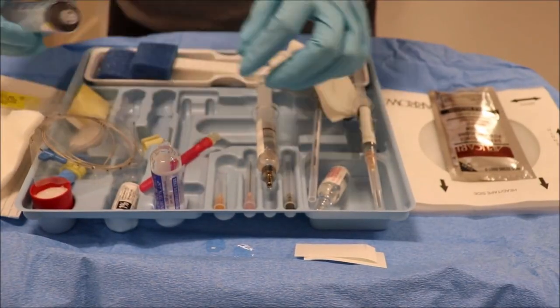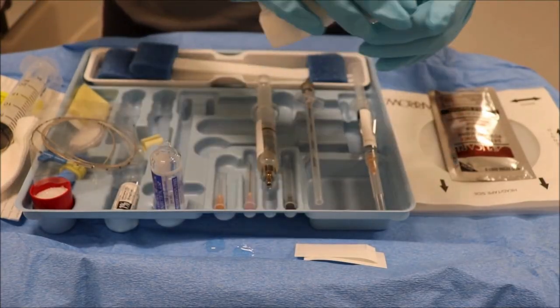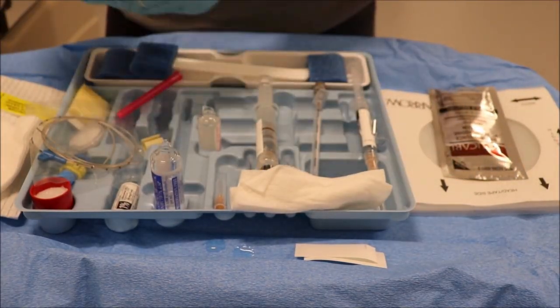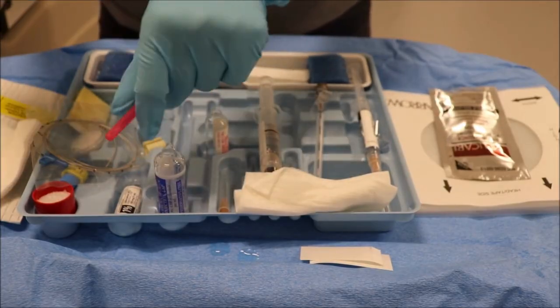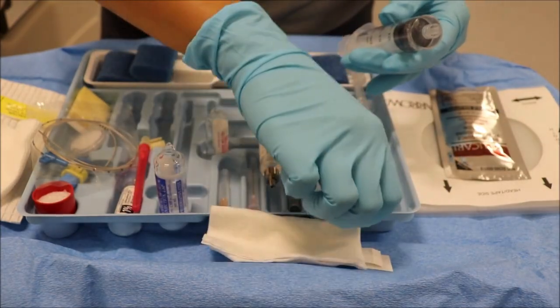The third medication to prepare is the test dose, which contains 1.5% lidocaine with 1 to 200,000 epinephrine. Using the straw needle, draw 5 ml into the 20 ml syringe and label it clearly. For reference, administering 3 ml of this solution delivers 45 milligrams of lidocaine and 15 micrograms of epinephrine.